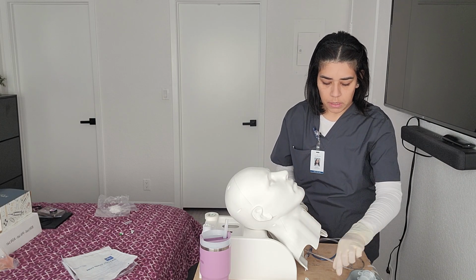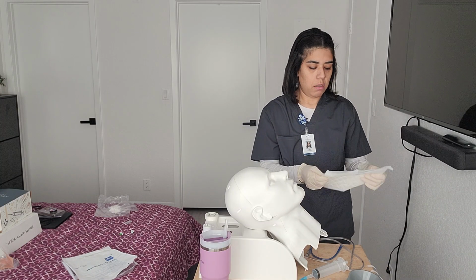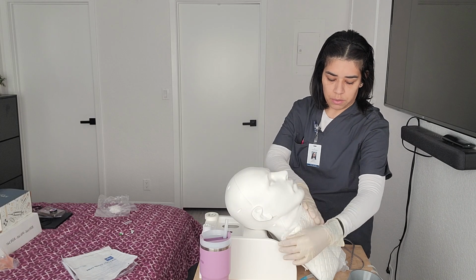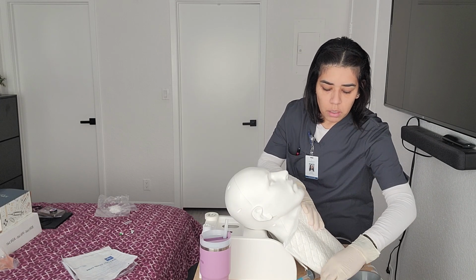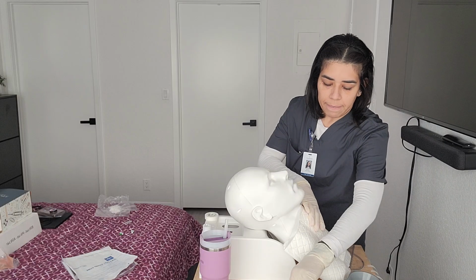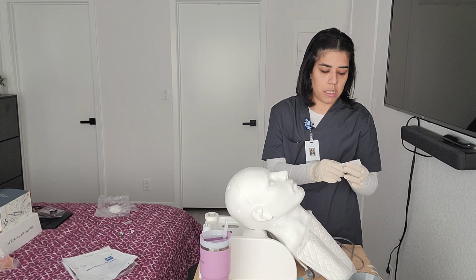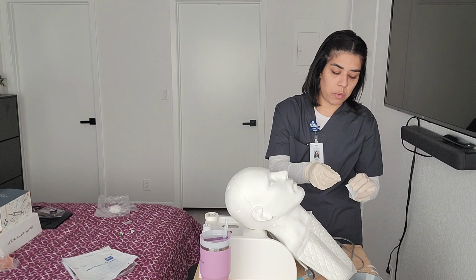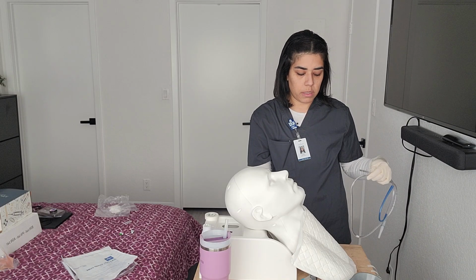Okay, now we're gonna give our patient the napkin. I'm gonna put it right on here. All right, sir. I'm gonna go ahead and open up one of these jellies so that we can lubricate the tip of the tube so it glides in easier. The patient doesn't have such a difficult time.